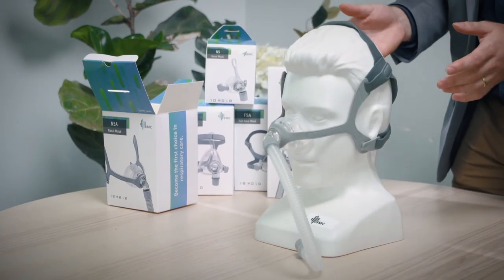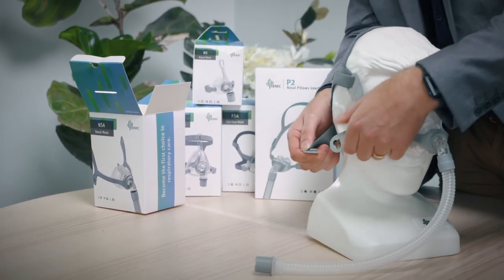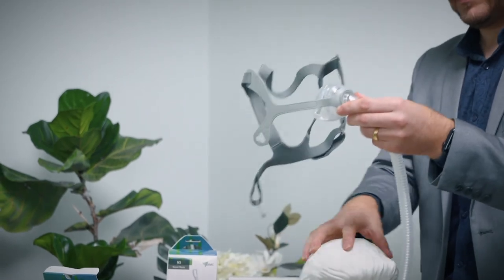To get the mask off at the end of therapy, put this clip on the side here, pop that out, and then pull the whole mask up over your head like so to remove.